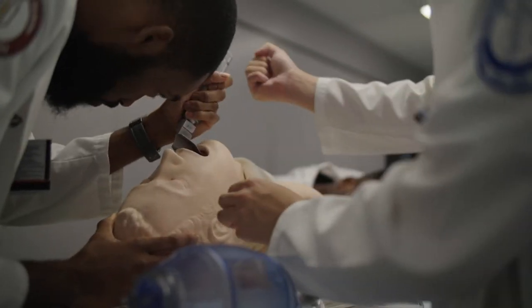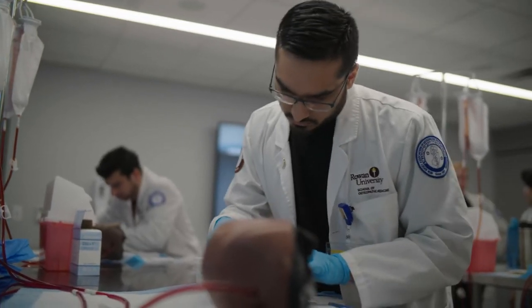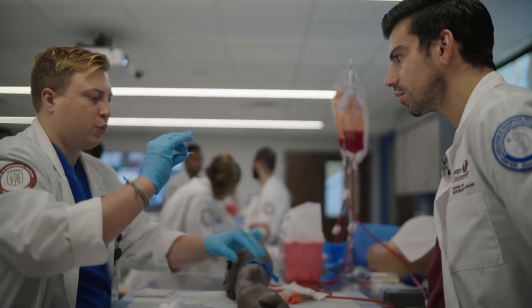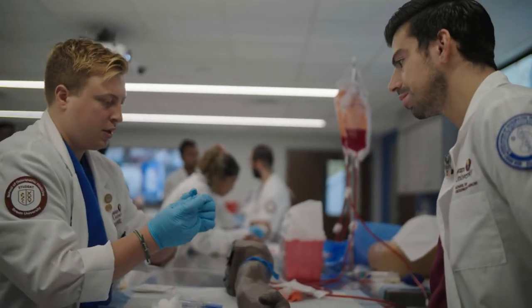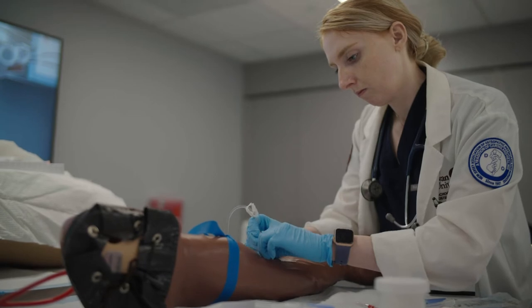Also significant to the training that happens here in the center is our procedural skills lab, where we have a longitudinal procedures curriculum. So we teach roughly a dozen skills over the course of their medical training, starting as early as the first year. Because if we do bevel down, it won't penetrate the skin as well, and it'll drag, right? And that's something that we start with on the task trainers or the simulated body parts, and ideally we progress them up to practicing on real humans.